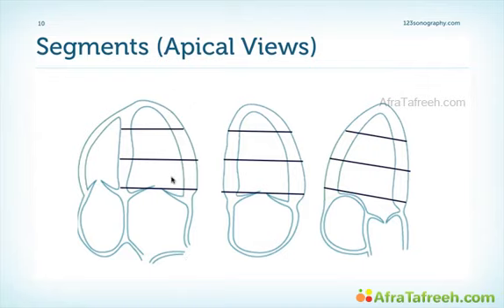Well, we have a segmentation into the basal, the mid, and the apical segments, and thereby we can describe different regions of the myocardium. This is the four-chamber view, so what we see here is the septum. Therefore, this must be the basal septum. What we see in the four-chamber view is usually the inferior portion of the basal septum.